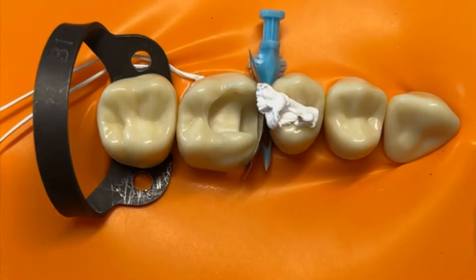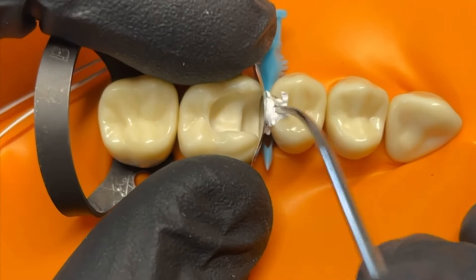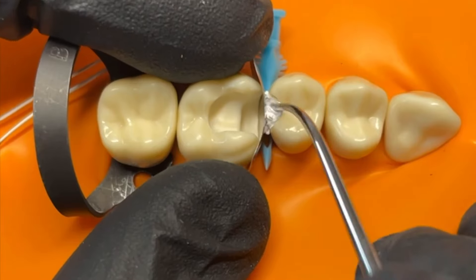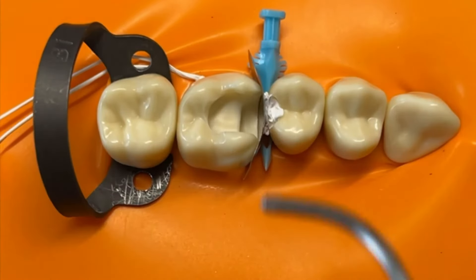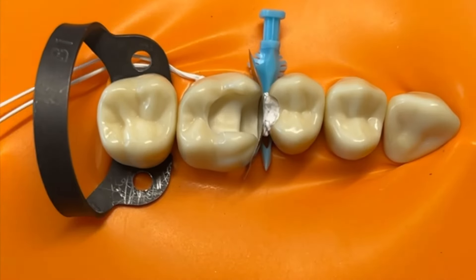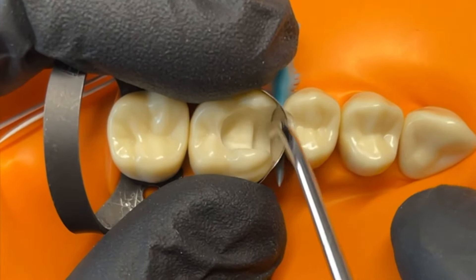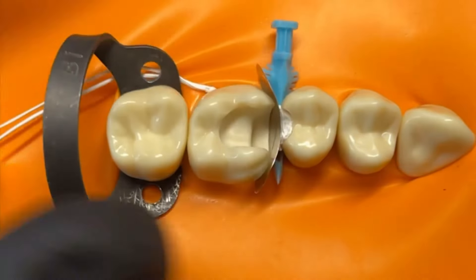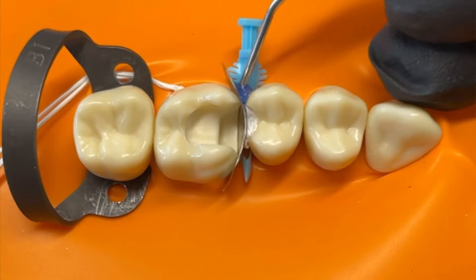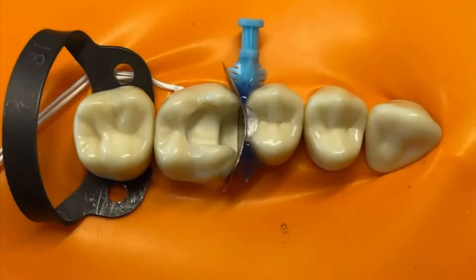One thing I've tried in the past is adding some PTFE tape into the adjacent cavity to try and share the space better, but whenever you're working with matrix bands you want to avoid packing up against them like this, because it tends to create distortion and it's very difficult to share the space as evenly as you'd like. Doing it this way and then securing with some liquidam generally makes a band stable enough to pack in, and that is an option for doing these back-to-back cavities.